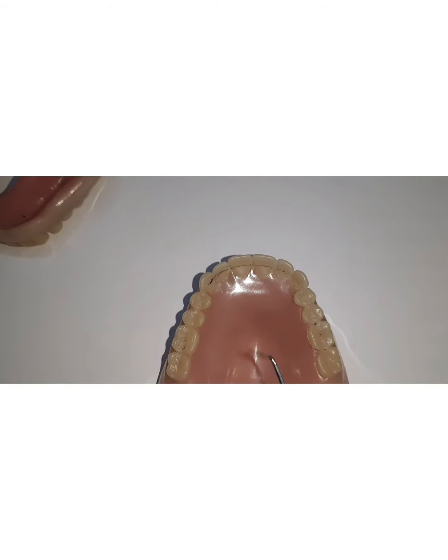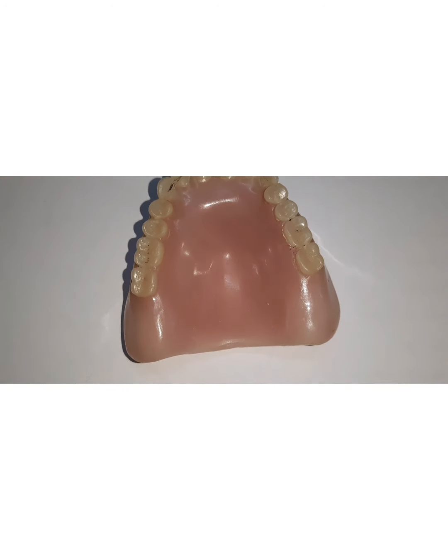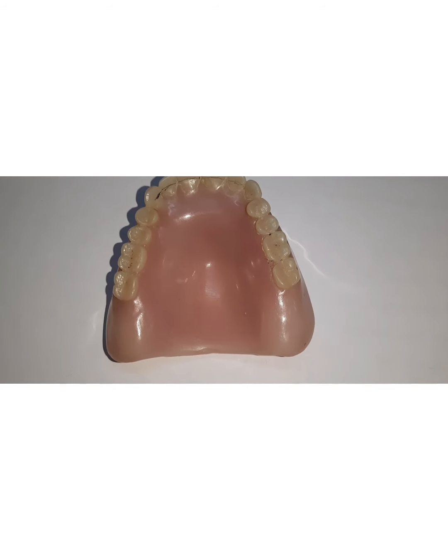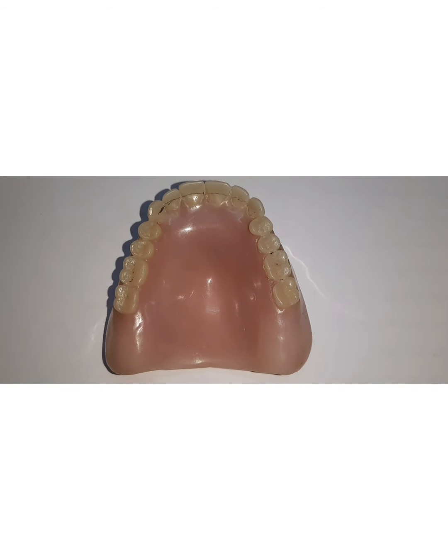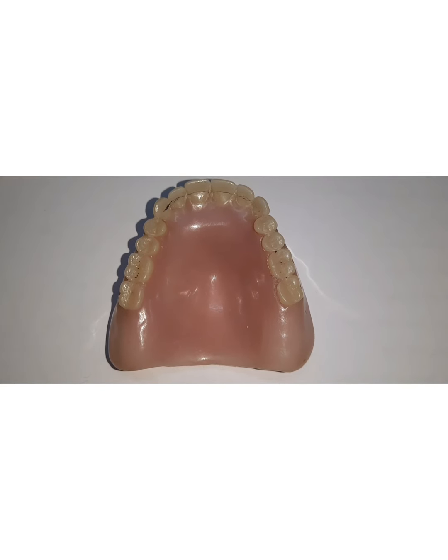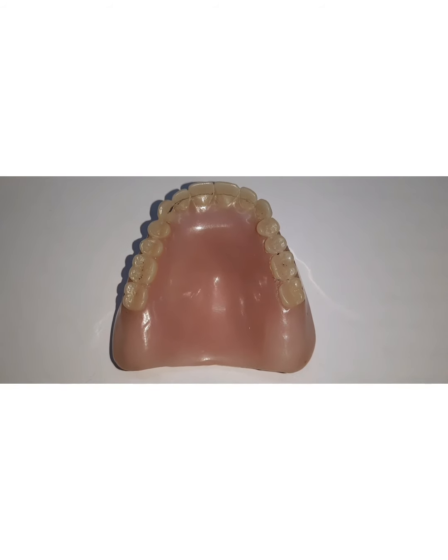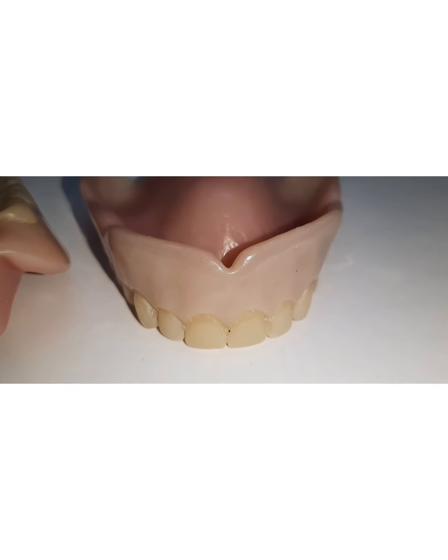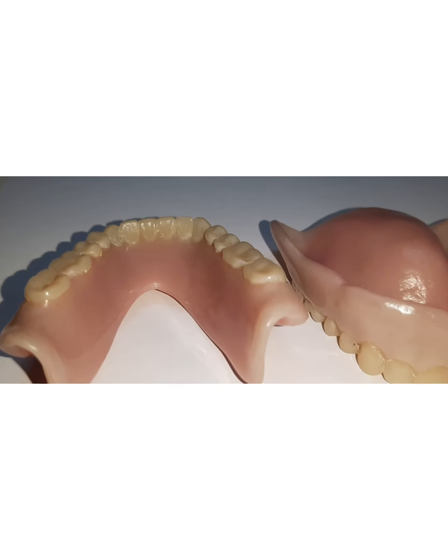The second surface is the polished surface, which you see all around. This is also called the cameo surface. By definition, it is that portion of the surface of the denture which extends in an occlusal direction from the border of the denture, and it includes the palatal surface. It is that part of the denture base that is usually polished, and it includes the buccal and lingual surfaces of the teeth, which we can see.